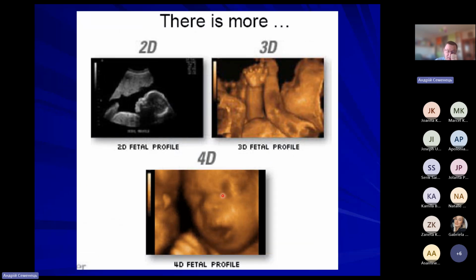Only quite recently, compared to CT scans, has it become possible to create three-dimensional and even dynamic ultrasound images. For a long time, there were only two-dimensional images, and here is the problem: why was it such a long way compared to CT scan?